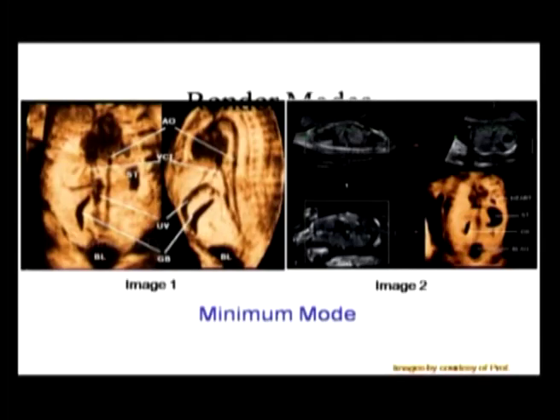So these are the great arteries coming from the heart, called the aorta. Right. And this is called the IVC, the inferior vena cava. So all these great vessels can be seen very clearly.